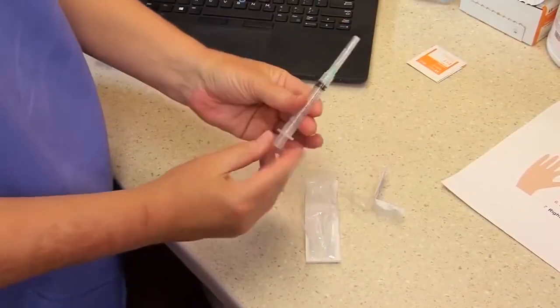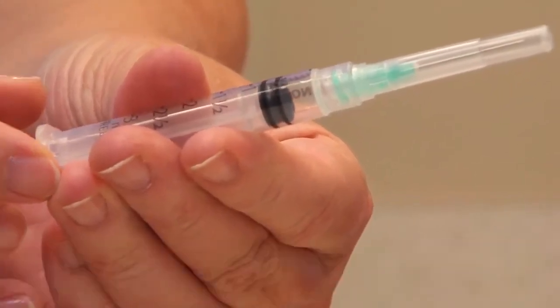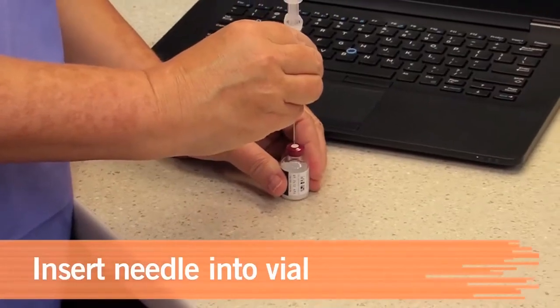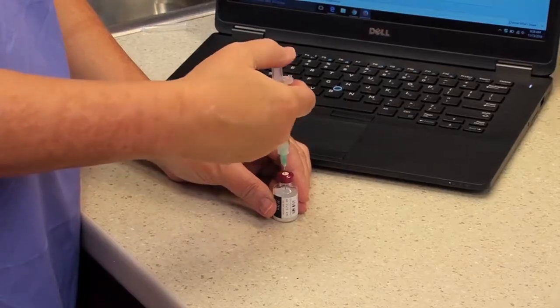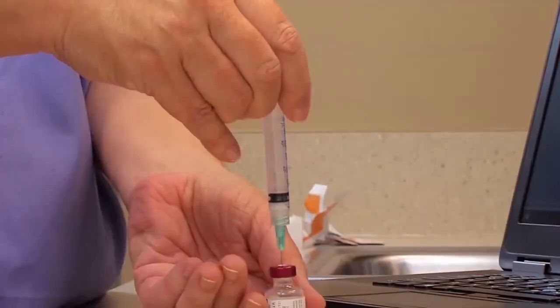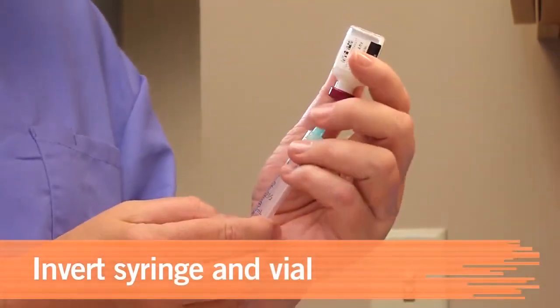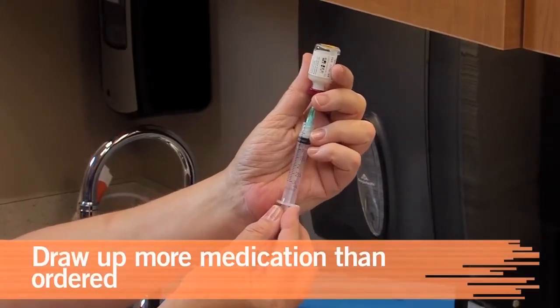With the needle cover in place, grasp the syringe plunger and draw up an amount of air equal to the amount of medication ordered. Uncover the needle. While holding the vial in place, carefully insert the needle into the center of the rubber stopper. Make sure the uncovered needle touches only the clean rubber stopper. Now, inject the air in your syringe into the medication vial. Without removing the needle, carefully pick up the syringe and vial and invert them. Hold them at eye level and slowly pull back on the plunger to draw up more medication than ordered.